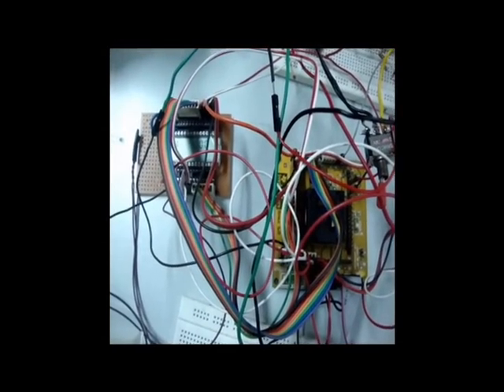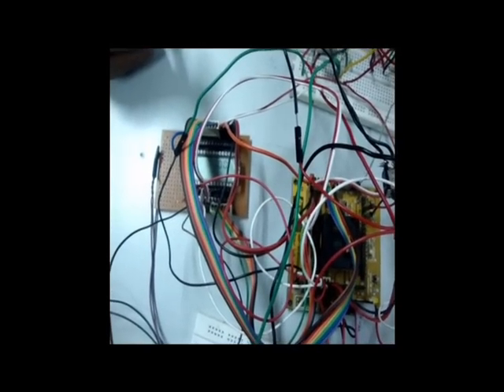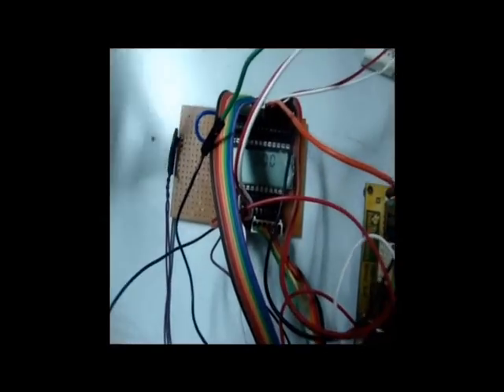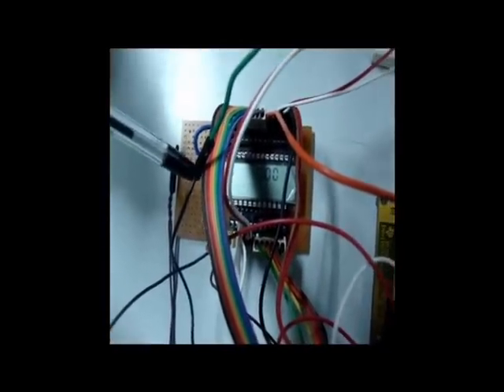Now on this microcontroller we have two algorithms running. The first one is the peak detection algorithm, which computes the heart rate, and the second one computes the oxygen saturation. The results obtained can be displayed on an LCD module. The LCD module utilized is the SB-LCD A4.